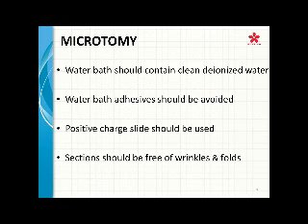Also, keep in mind, your section should be free of folds and wrinkles. If your section is wrinkled or folded, that may be the site that the pathologist is actually expecting the immunohistochemistry stain. That's the site they're looking for to be positive or negative. I've seen it happen many, many times when a pathologist will come back and say, there's only this very small spot and there's a fold over it, so I need you to recut it. And when it gets recut, that spot is no longer there.